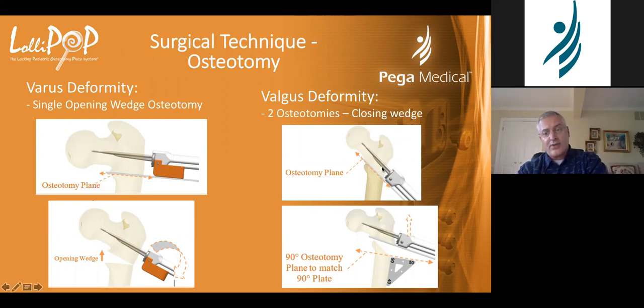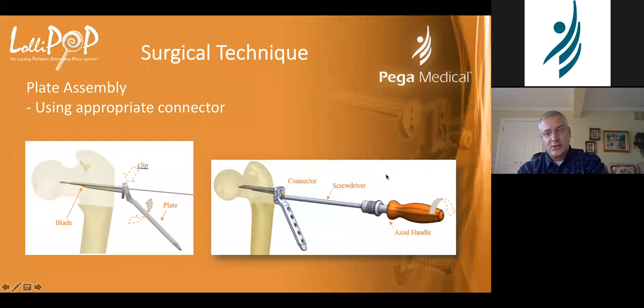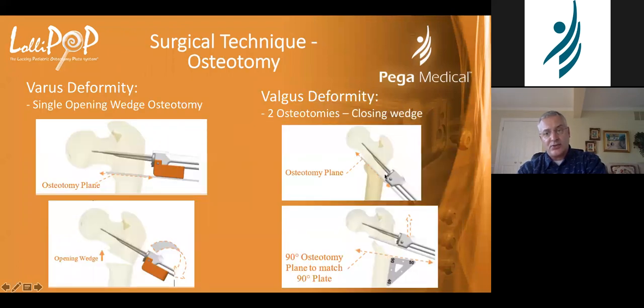Again, with the valgus plate, you'll see the little stop sign, right? This is our little yield sign that's going to go into our blade. And I've made my cuts too close. And then this will then run into my distal fragment, and I have to do a little bit of carpentry.